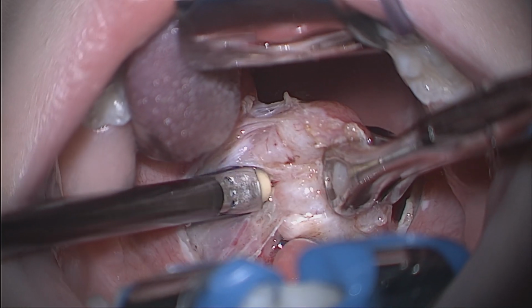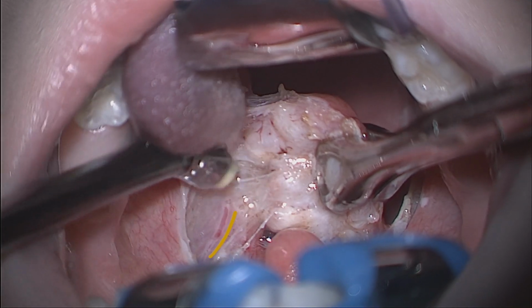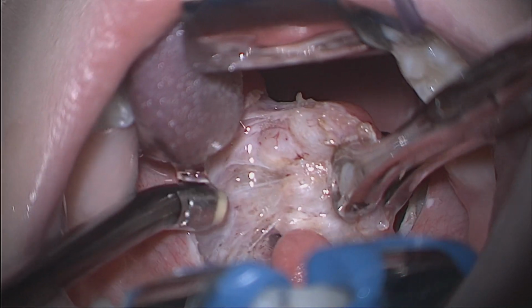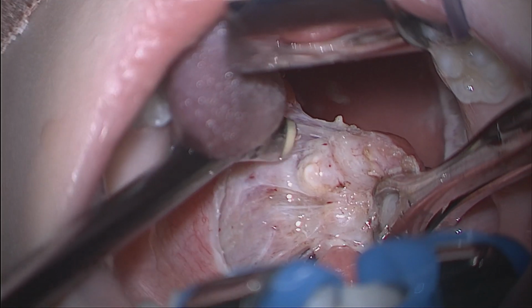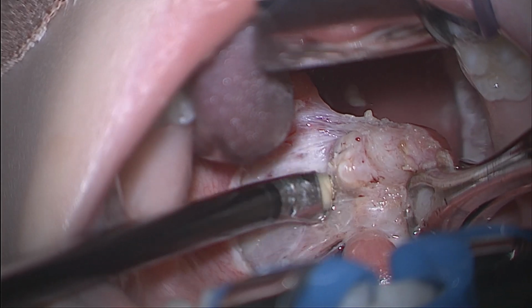The advantage of the microscope in identifying blood vessels is again demonstrated here, where a small blood vessel is easily seen and so can be cauterized before any bleeding occurs. As before, the dissection continues towards the inferior pole until the entire tonsil has been dissected.